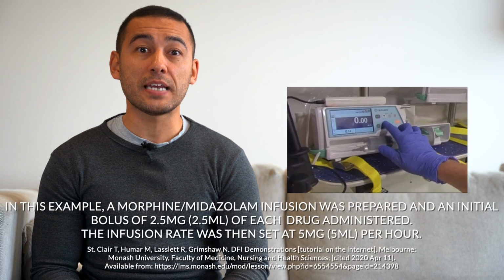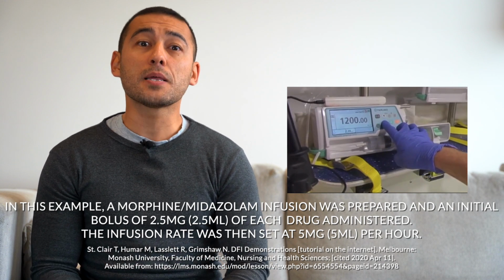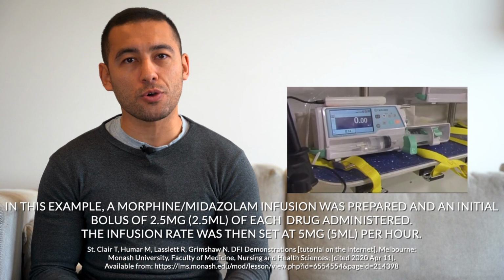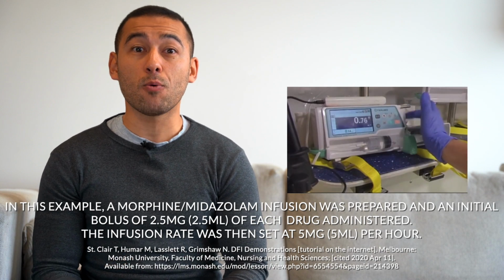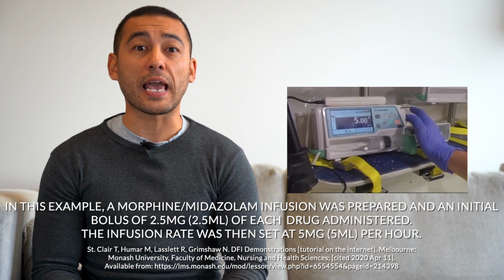An important decision to make is whether to continue positive pressure ventilation via the Quick-Trach or allow the patient to wake up and resume self-ventilating. The answer to this will depend on several factors, including the reasons for the initial intubation attempt, as well as the patient's current status. If, however, the decision is made to continue positive pressure ventilation via the Quick-Trach on the way to hospital, then post-procedural sedation must occur. It may be beneficial to start with an initial bolus of sedation to ensure an effective therapeutic level before setting an infusion rate. One final consideration is whether to use long-term paralysis.